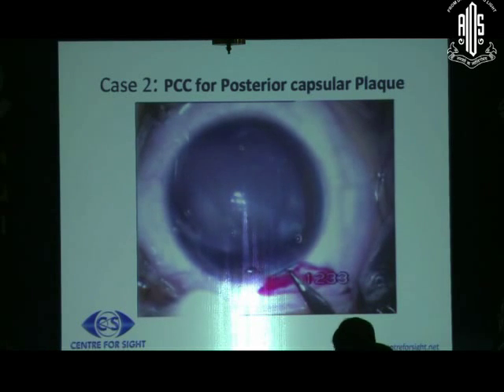I'll show you a case where, in this particular case, it's a pediatric cataract, and one of my colleagues was doing it.